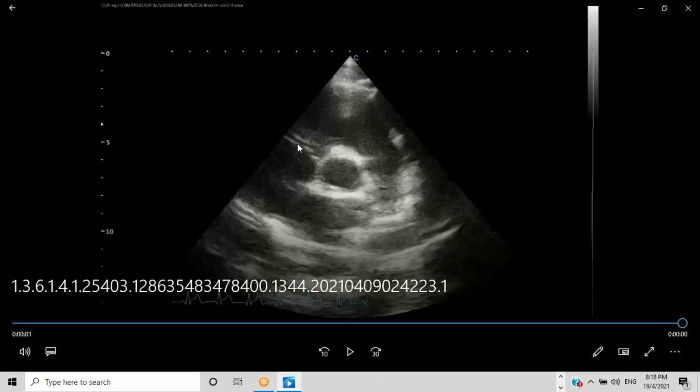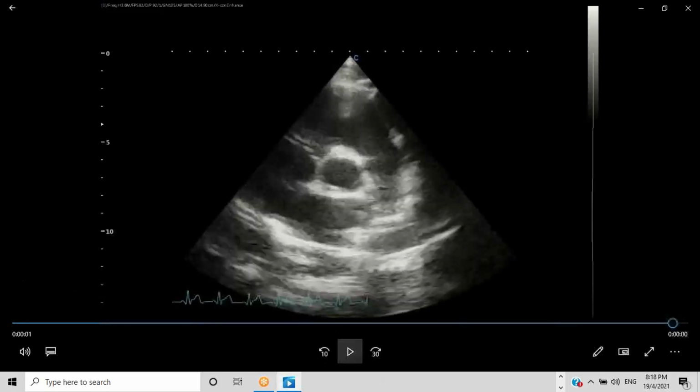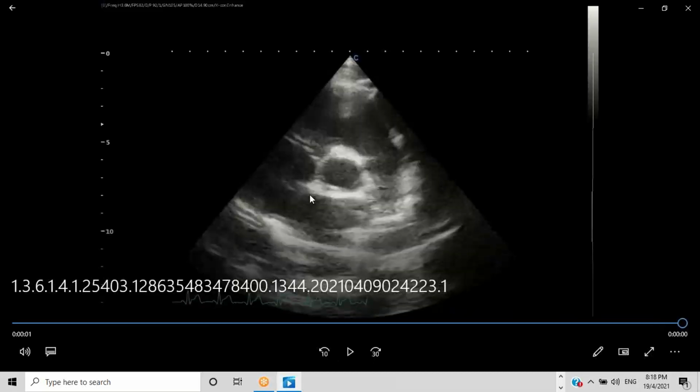This is a tricuspid valve right there, the right atrium, and the atrial septum is right there, so we can play. So again, remember, if this is your atrial septum, the coronary cusp that is adjacent is the non-coronary cusp. Then the right will be there and the left will be there.